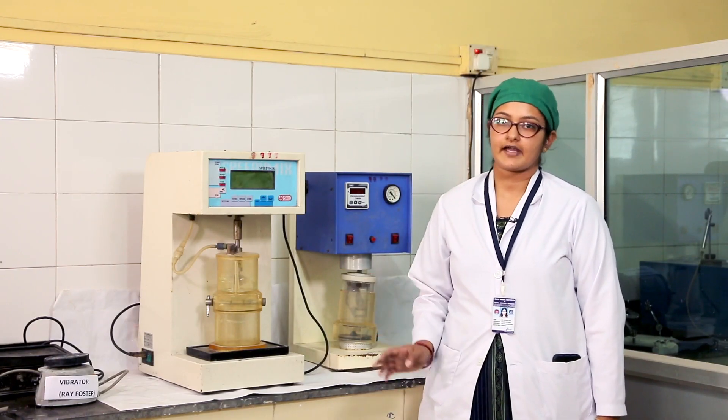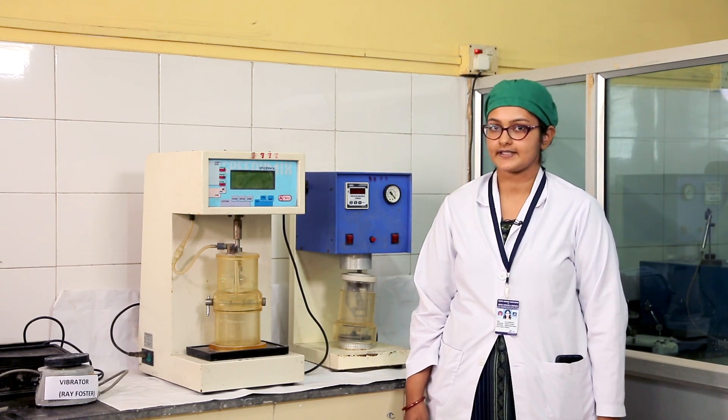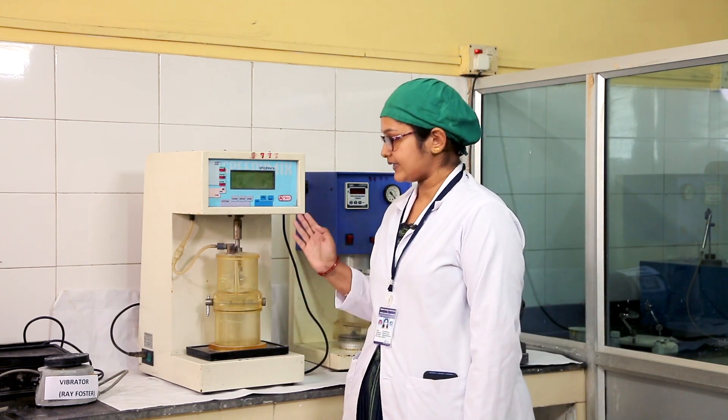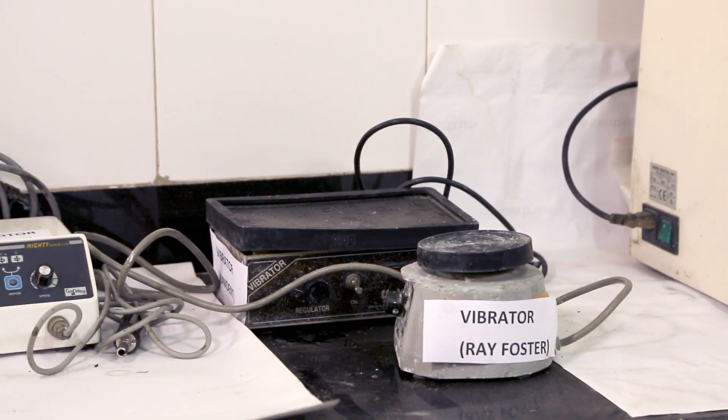These are vacuum mixers where dental plaster is thoroughly mixed to create a smooth consistency. After mixing in the mixer, the dental plaster is placed over this equipment. This is known as a vibrator. In the vibrator, all the trapped air bubbles from the plaster mixture are removed.